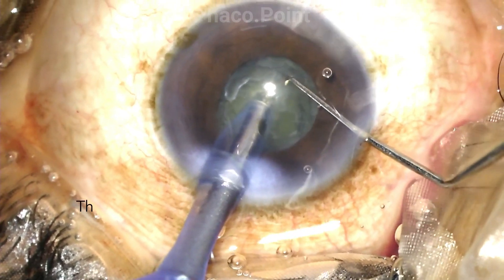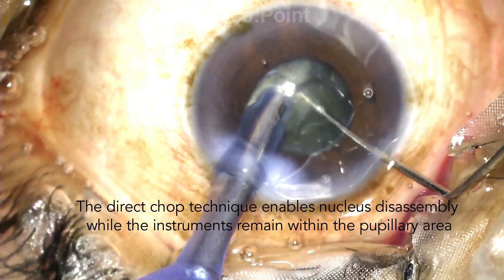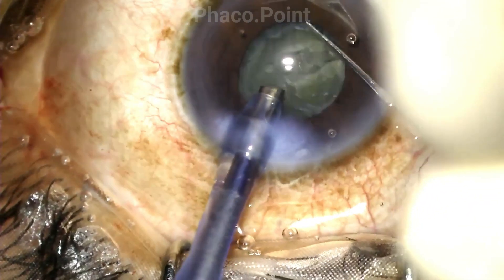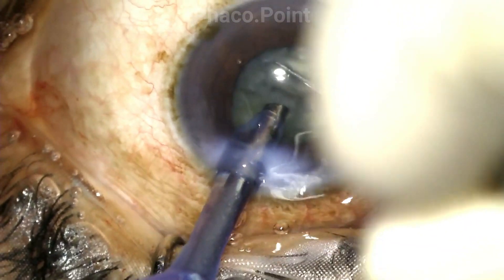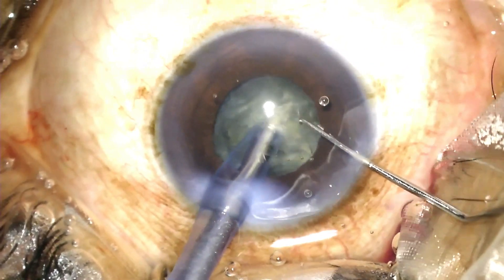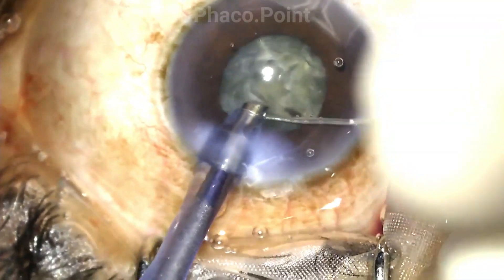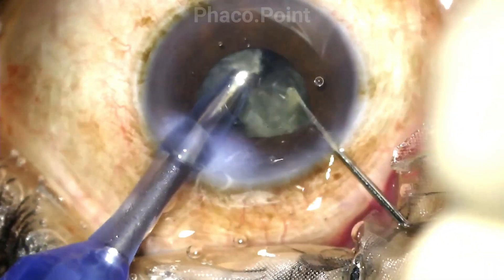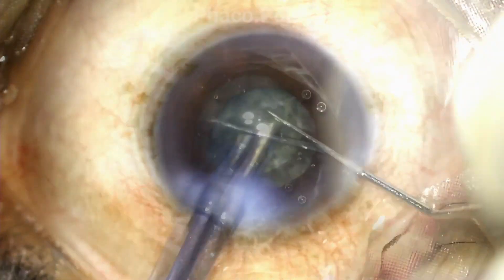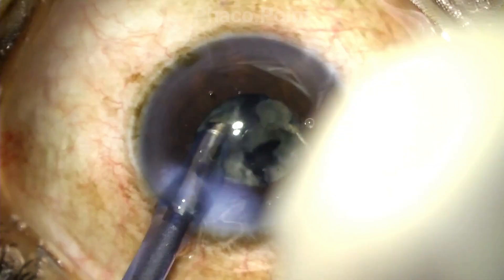It's very important to ensure that your instruments remain visible throughout the surgery — that is, the phaco tip and the chopper should always remain within the pupillary margin. After creating the first chop, I rotate the nucleus and try to break it down into two hemi nuclei. I then proceed to chop this hemi nucleus into smaller emulsifiable fragments. Please note how at all times my instruments are well within my line of sight. I'm ensuring there is no accidental damage by the phaco tip or the chopper to either the rhexis edge or the pupillary margin. The entire nucleus is similarly downsized into multiple emulsifiable fragments.